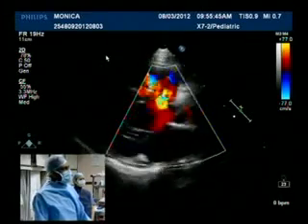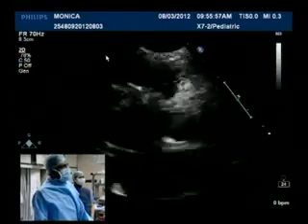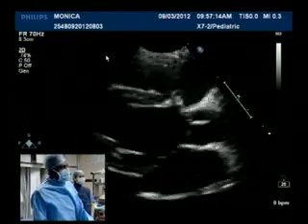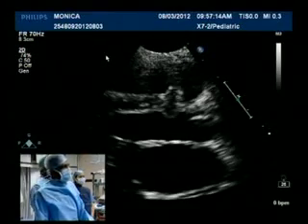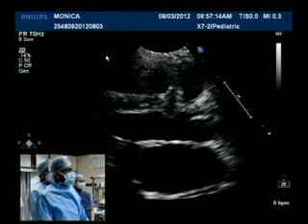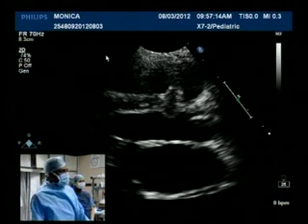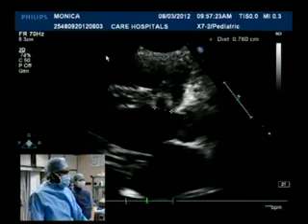The ADO2 has got a central waist which is connected by a narrow stem of the device to the retention skirts on either side. So even if you have the septal length a little bit more, there is a possibility that the device can stretch rather than have a compressive effect on the septum. So 6-4 should be okay in this location unless you have a true muscular VSD, either mid-muscular or apical muscular.